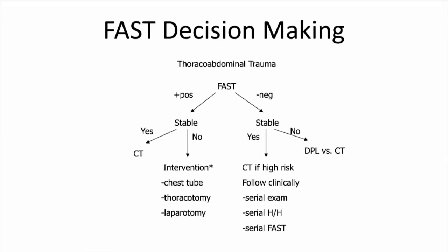Didn't talk about this too much. We talked a little bit about penetrating trauma, but in penetrating trauma, the heart is going to be one of the most important things to look at. So if they have penetrating trauma, you want to see if they have tamponade that you can quickly address, and that may affect, if you're working with your surgeons, how their surgical approach is going to go, if the patient can go to the operating room, or if you need to do a bedside thoracotomy.